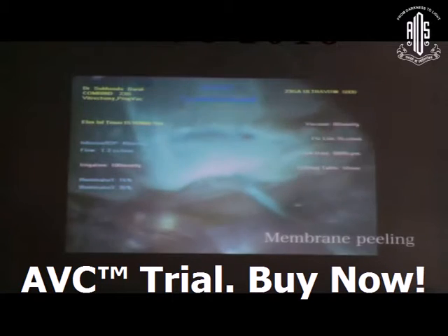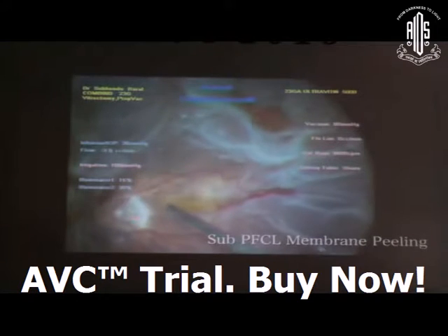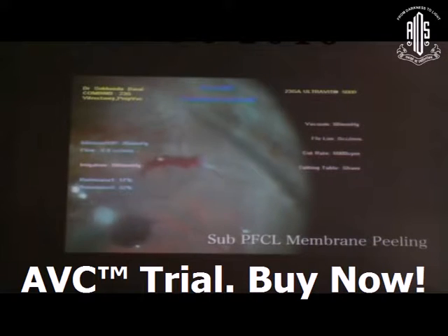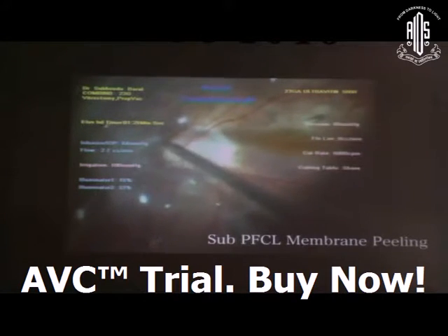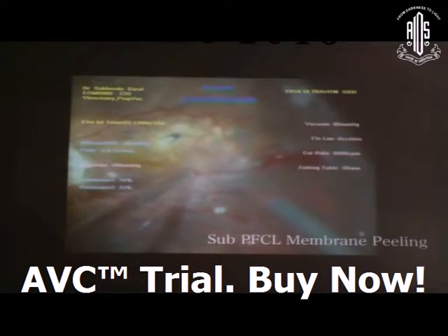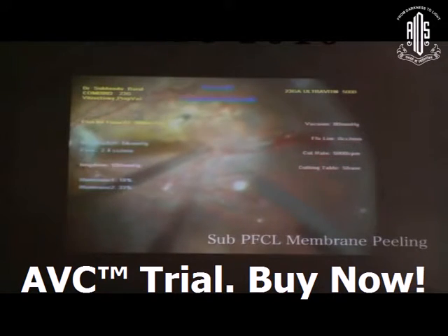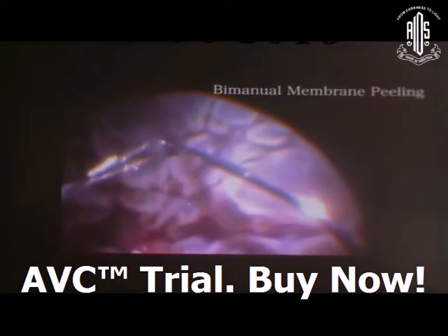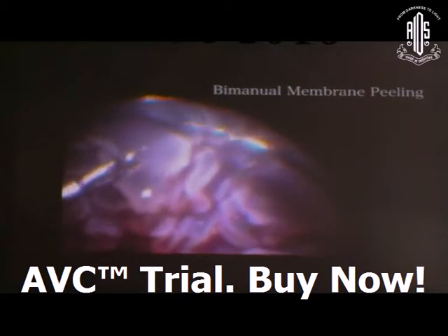The next step is membrane peeling — star fold management. You release the fixed folds, then after maximum release, inject PFCL to stabilize the posterior pole and assess how many residual fixed folds remain. Remove the membranes. Opacities overlying the vessels indicate fixed folds are still present. Bimanual membrane peeling is more necessary in PVR D2 or D3 situations.